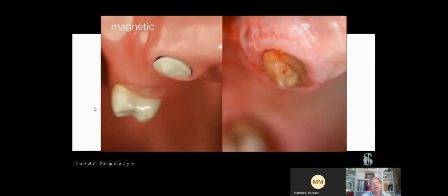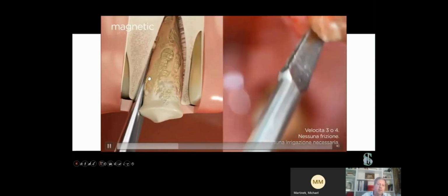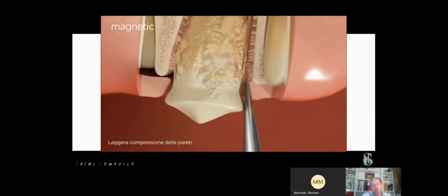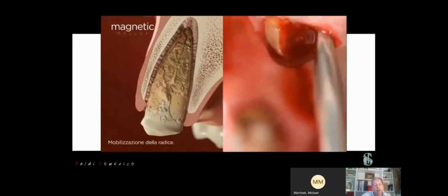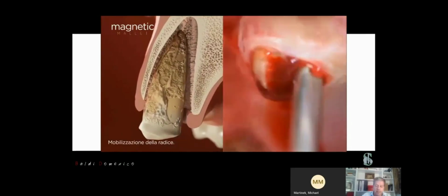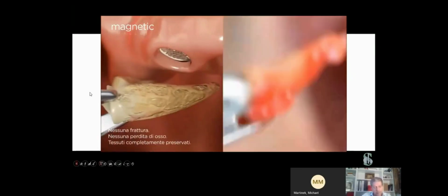In this video, you can understand it's possible to do this extraction. In this virtual video, you can see that sometimes we have an ankylotic root, and with this instrument it is possible to cut the ligaments and then to remove the first part of the bone that is ankylotic, in order to have a compression of the hole and a mobility of the root. And then we can immediately have the movement of the root, and with the forceps it's possible to take away the root.